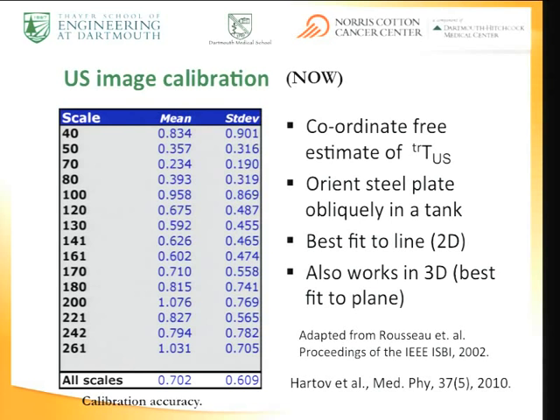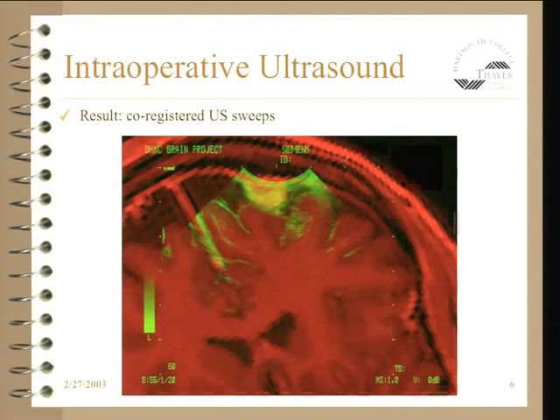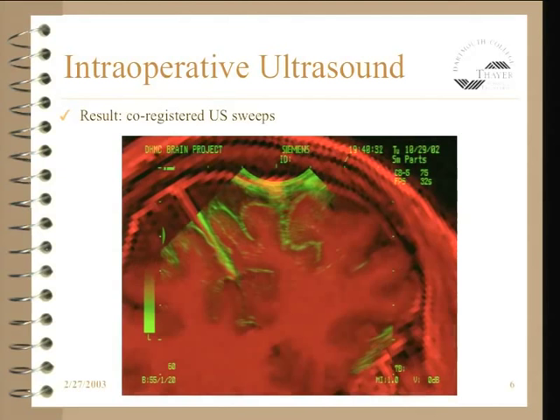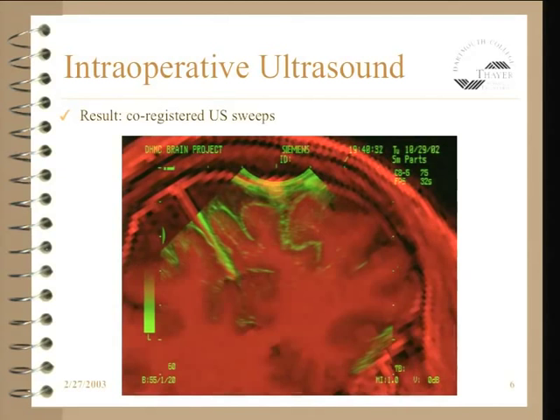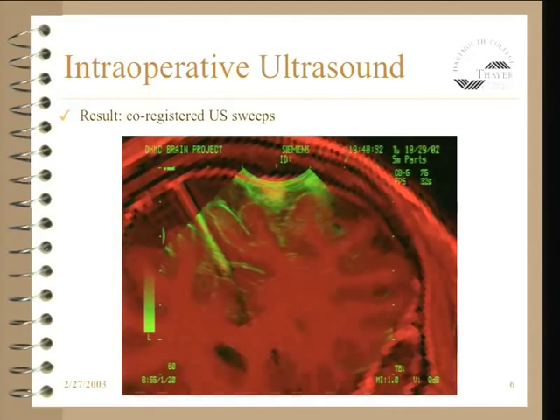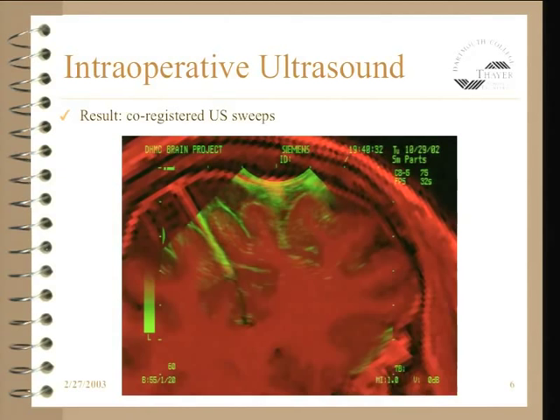So despite those technical challenges and the effort that went into it, this is circa 2003. Again, I copied this from a slide that Alex had, and this was playing in the front panel. You could do pretty well. So this is co-registered ultrasound, tracking the scan head as it goes along. And I think we all learned, and clinicians knew this, if you look at this ultrasound scan in isolation, you can't interpret it nearly as well as when it's overlaid on the fine structural resolution. In fact, if you were to look at this, you'd probably think, what's this?